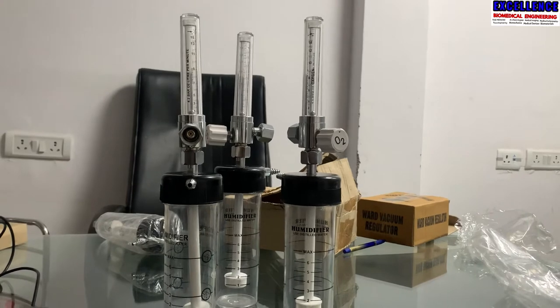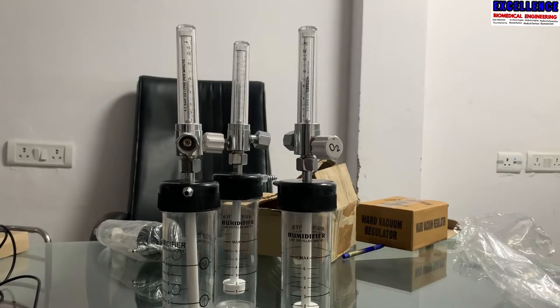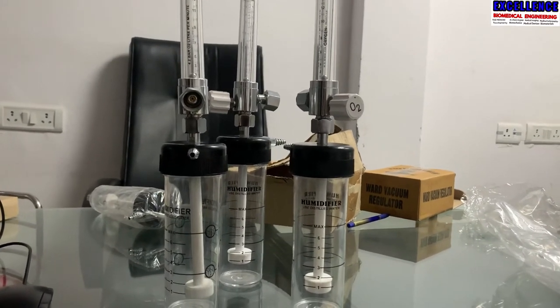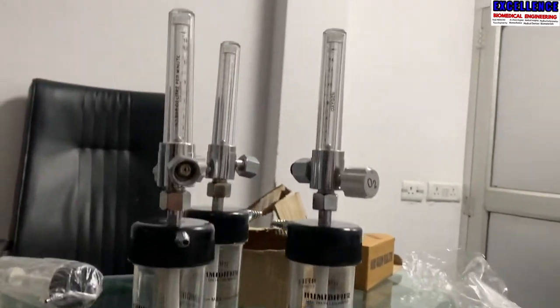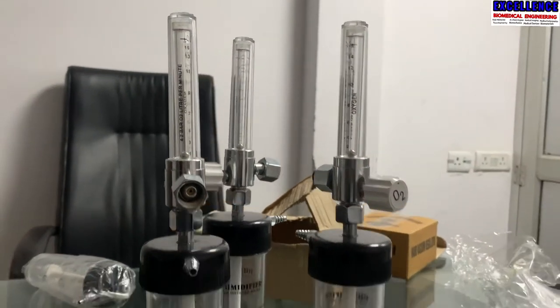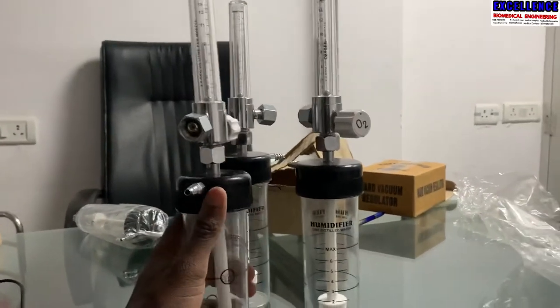It is mostly used in the hospital, at the end of the medical gas pipeline supply. So what is basically a humidifier bottle? This is the humidifier bottle, and this is the oxygen regulator here, and this is the gauge. What is this instrument in totality — what is it and what does it do?